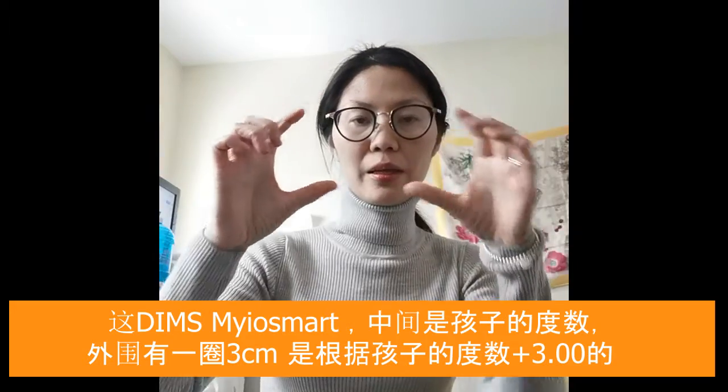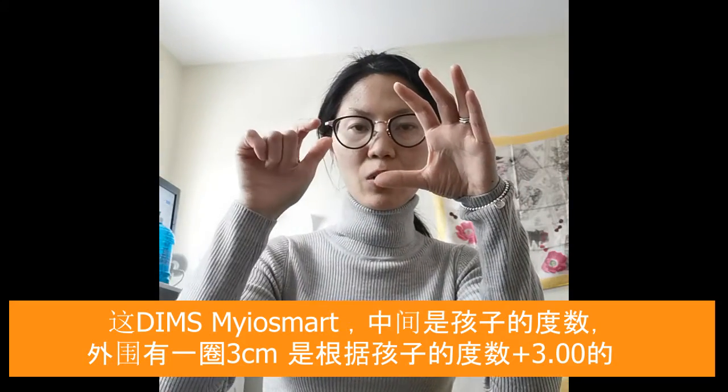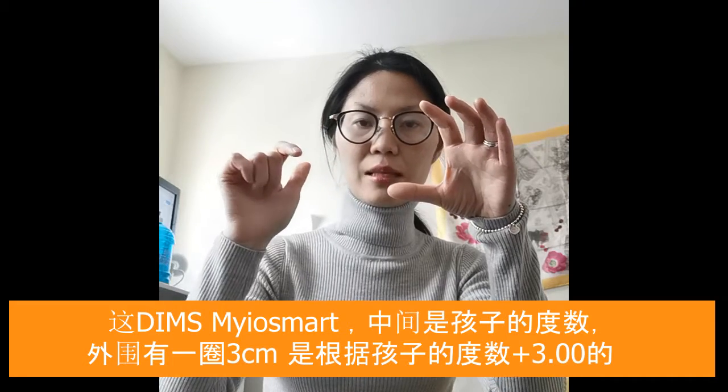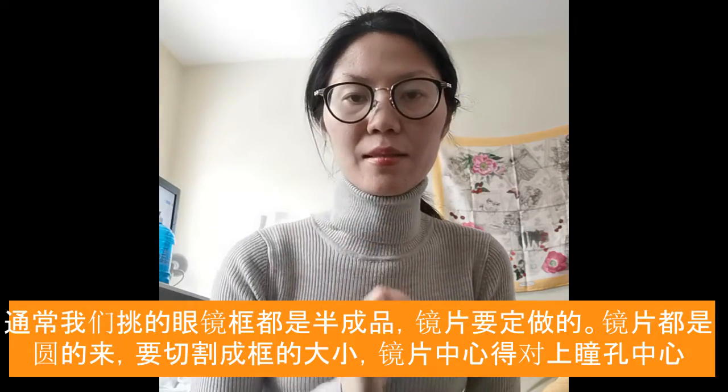This lens comes in circles, and inside there's a ring of little dots that has a plus three power over the original power of the child's glasses, and then the inside is a circle of the original prescription. These are really specialized lenses.